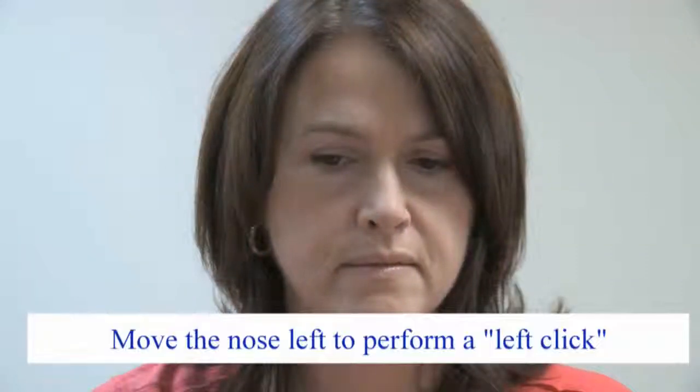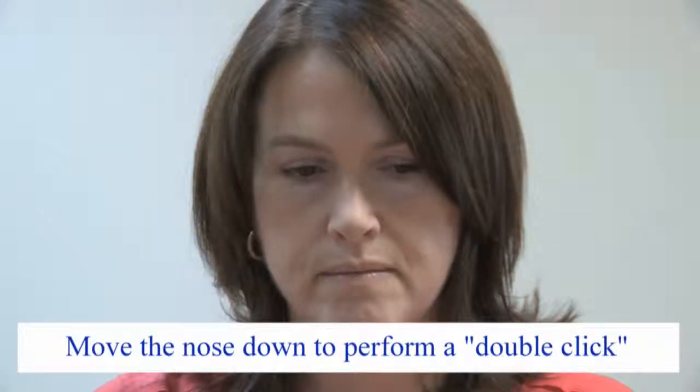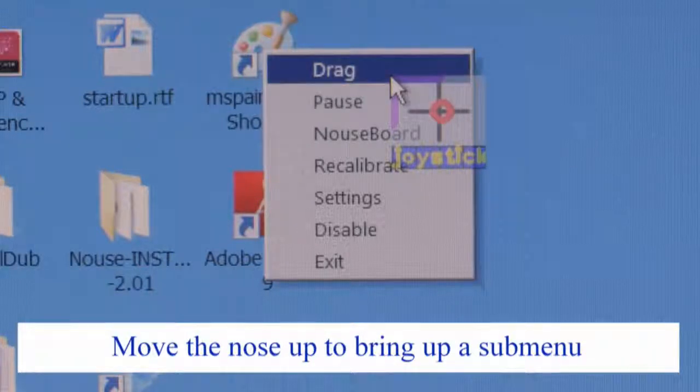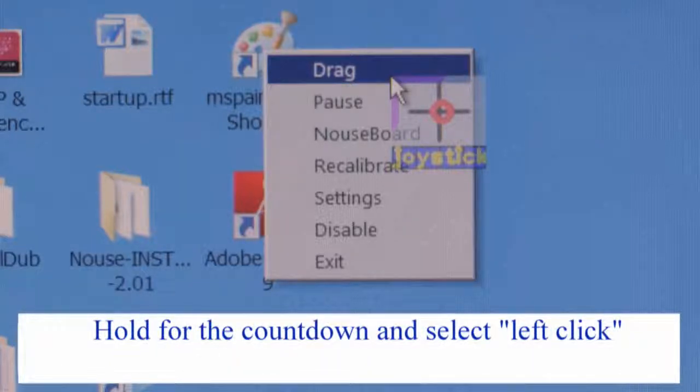Once the user is in clicking mode, the user has one of 4 clicking choices. 1. Move the nose left in order to perform a left click. 2. Move the nose right in order to perform a right click. 3. Move the nose down in order to perform a double click. And 4. Move the nose up in order to bring up a submenu of other actions. These include drag, pause, Nouse board, recalibrate, settings, disable, and exit. The user can select the desired action from the submenu by moving the Nouse cursor up or down along the menu options, holding for the countdown, and then selecting the left click.